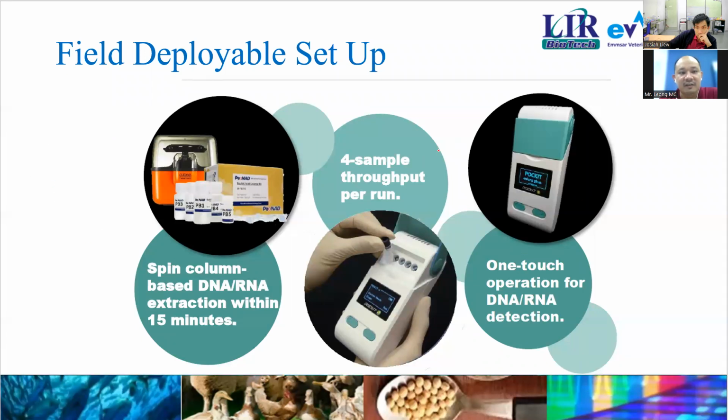The invention of this field deployable setup lets the farmer test immediately in case of suspected disease.